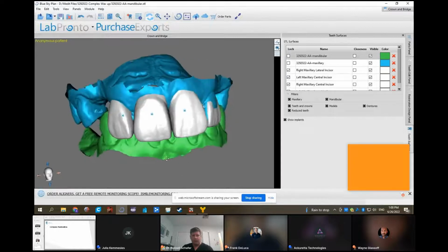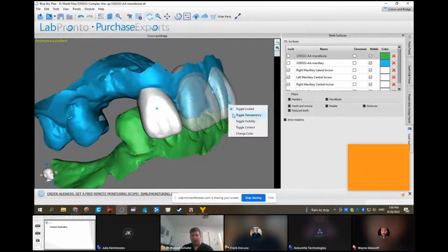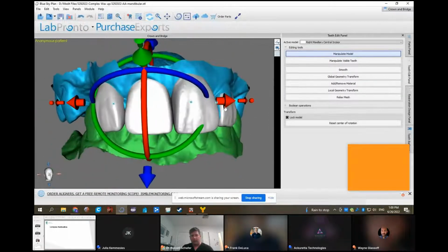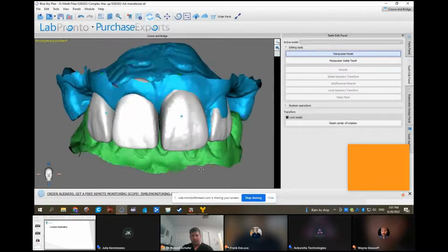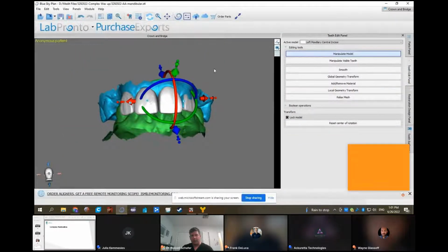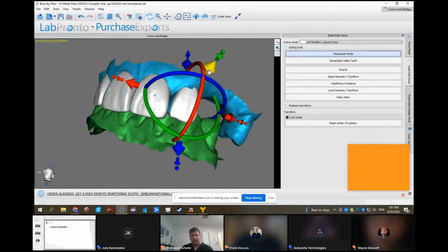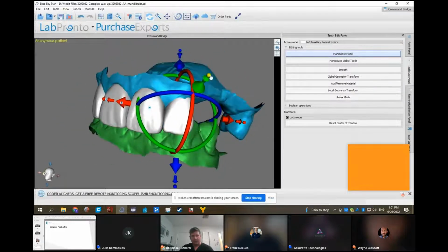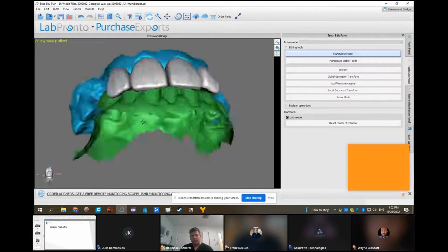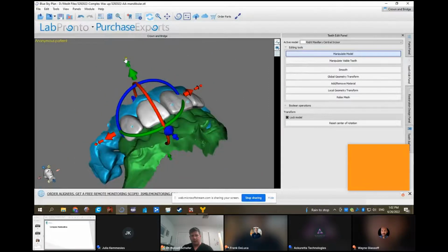And for him, I'm not too worried about opening up the bite, because I have to put teeth somewhere here. I just decided, okay, let's put them on there and see what it looks like. So what I'm doing here is determining the incisal edge that I want, and also how much connection space I want between each of the units, because I'm going to put this all together as one piece. And for him especially, I didn't quite know whether I was going to do this as one piece or as two pieces, 7, 8 and then 9 and 10 as two different bridges.